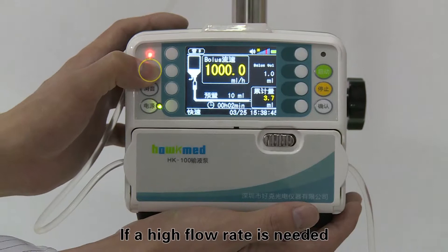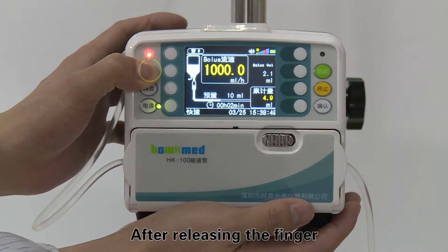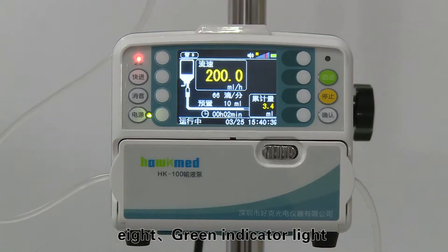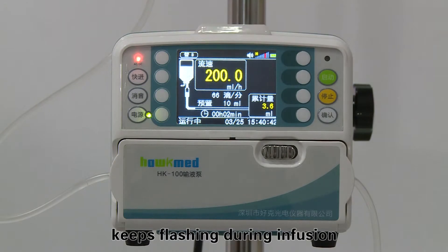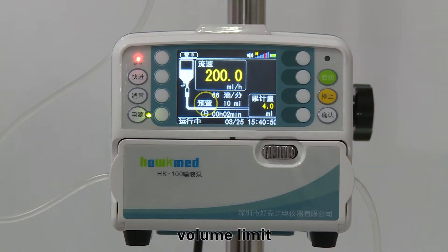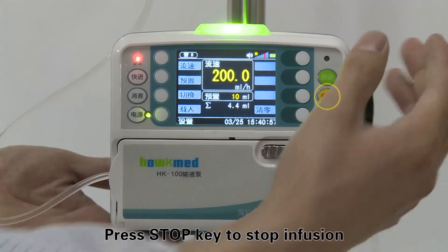If a high flow rate is needed, keep pressing and hold the bolus key. After releasing the finger, the flow rate returns to the original rate. Step eight: the green indicator light keeps flashing during infusion. The LCD screen displays information such as flow rate, volume limit, accumulated volume, and remaining time. Press the stop key to stop infusion.